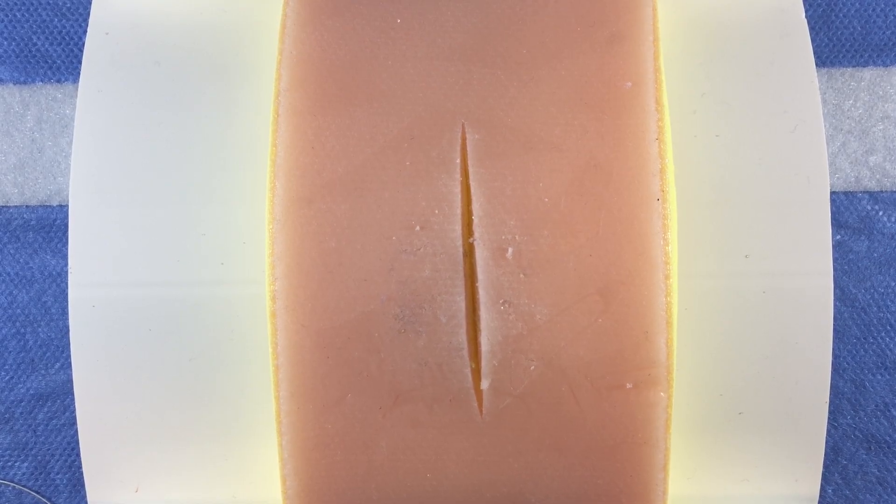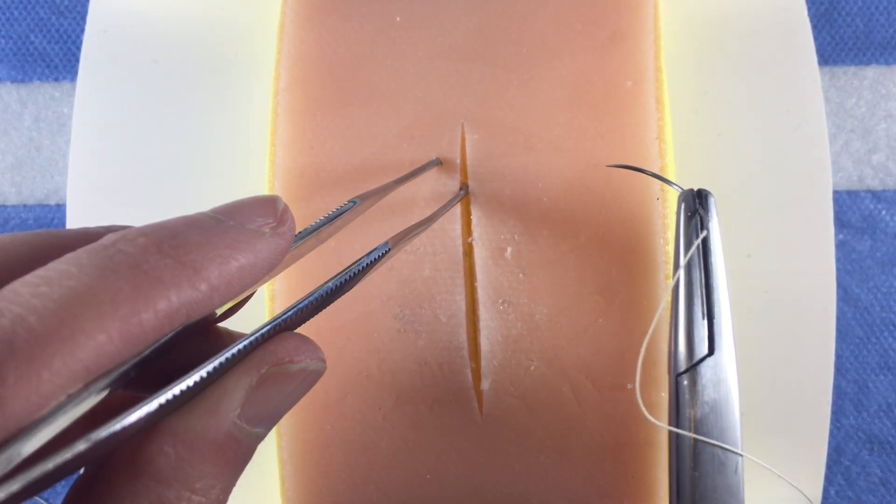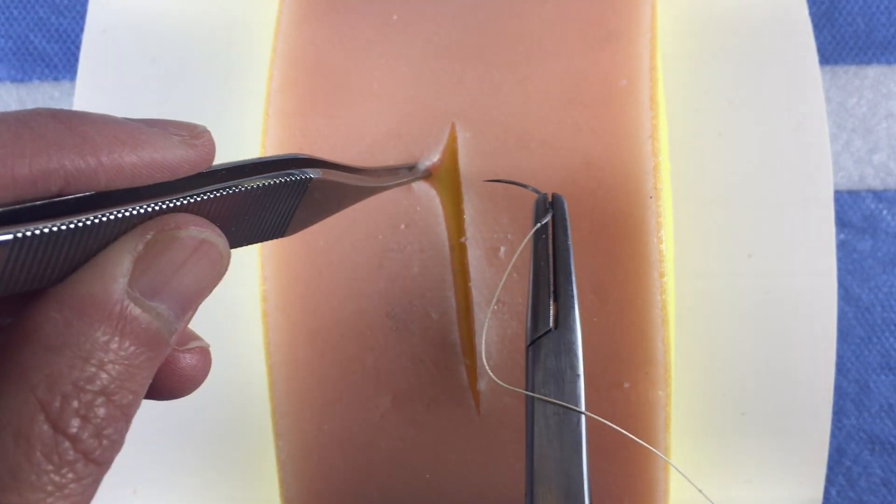The dermis is the whitish pink layer that is just deep to the skin surface and just above the yellow subcutaneous fat. To expose the layer, grasp the skin with the Adson forceps in your non-dominant hand and evert the skin edge.